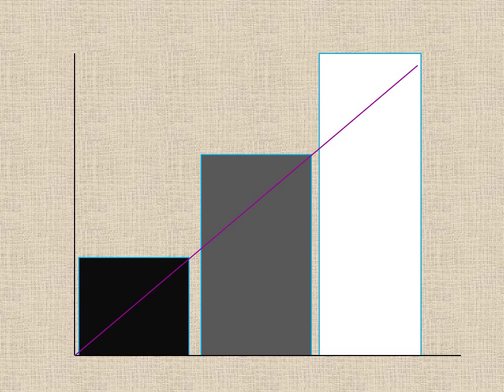For a little more sophistication, the machine could decide that a third of the weaker signals will be black, a third of the more medium signals will be grey, and the top third of the stronger signals will all be white. So now we have a computer screen that's displaying exactly the same information, but in a different form, where pixels now have 3 colours rather than 2. This would give you less contrast, but a bit more definition of some of the more complex tissues.